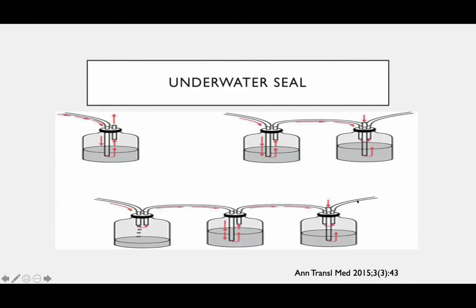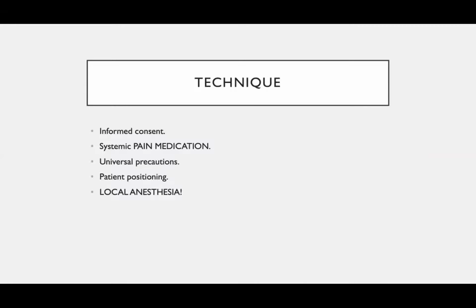Then they developed the three-bottle system, as you have seen. They just added the container itself, the collecting chamber, so it can collect the fluid or the blood that's coming from the patient's pleural cavity, and for the air, it is regulated by the underwater seal. And then you have the suction here. We are going to show you more pictures in real life.